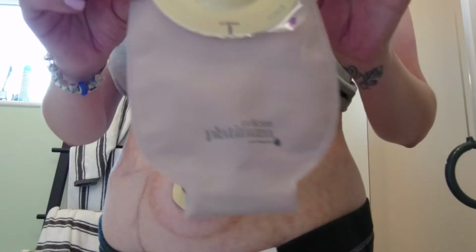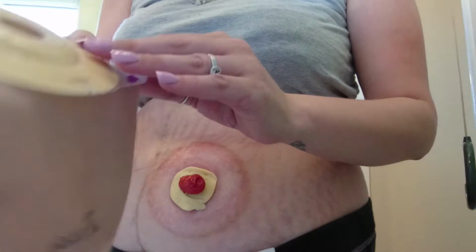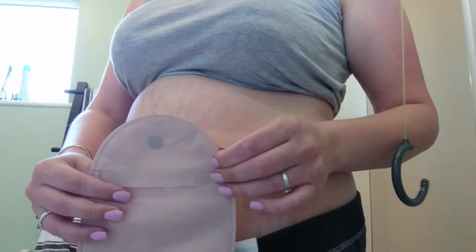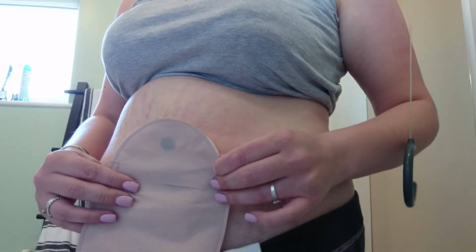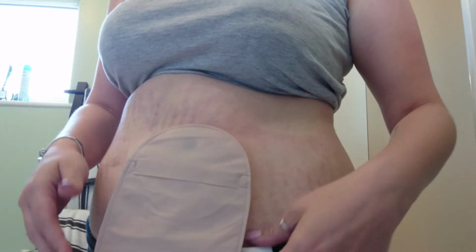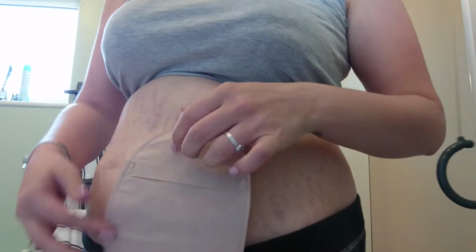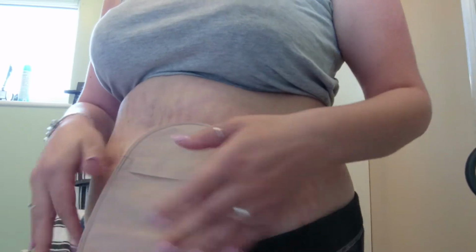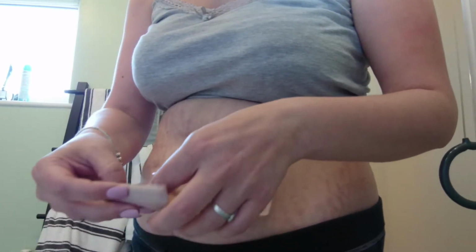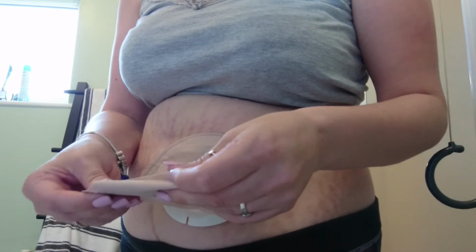And then I've got my bag, which is the Pelican bag, which is, I also use a convex already pre-cut. I just literally take off the template that I've cut and I fit it in as such. Give it a good old press down, and give it a good check. So that's all done, that's all stuck, and there we go. And that is my bag change done in just about 3 minutes.